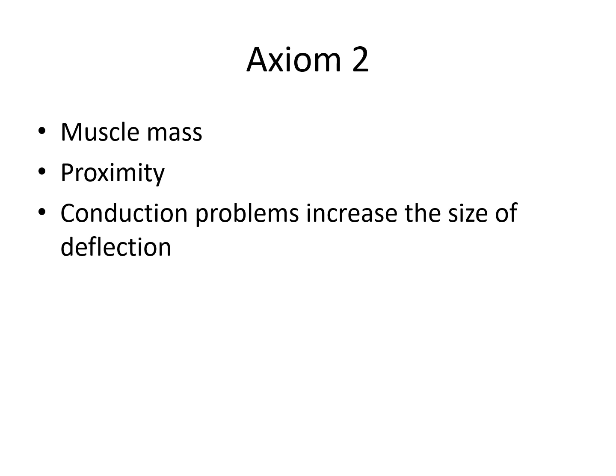And then finally, if you have a conduction problem, you will have essentially an increase in the size of the QRS. This has nothing to do with an increase in muscle mass or proximity, but simply a reflection of the fact that it now takes longer to depolarize, which means that the area under the curve of a QRS with a conduction problem is going to be larger than that of the one without. Notably, this will only be visible in the leads that are affected, that are looking essentially in the direction in which this conduction problem is occurring. More on that in a second.